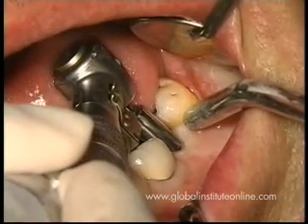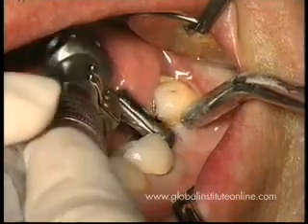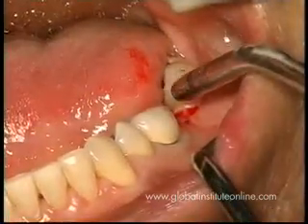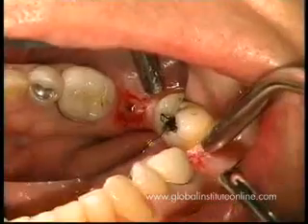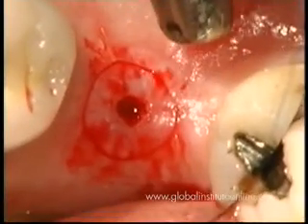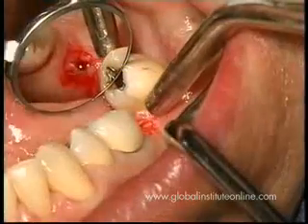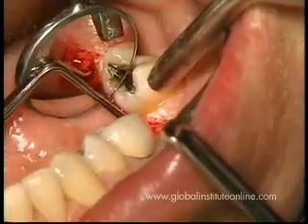So the goal is to make a very clean, round cut within the gingiva, which is being guided by this surgical pin. Now we can see the demonstration of this clear, round excision of keratinization, and in the middle you can see where the 2 millimeter drill perforated the gingiva and the bone.